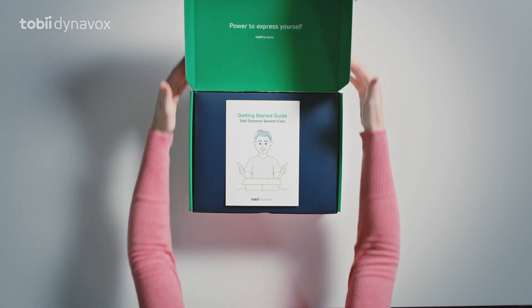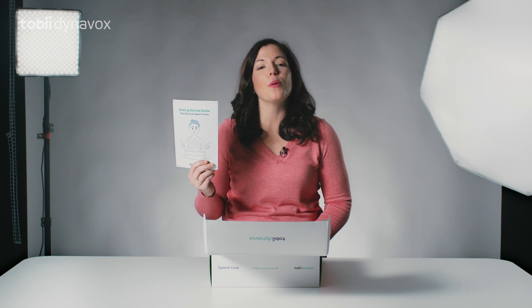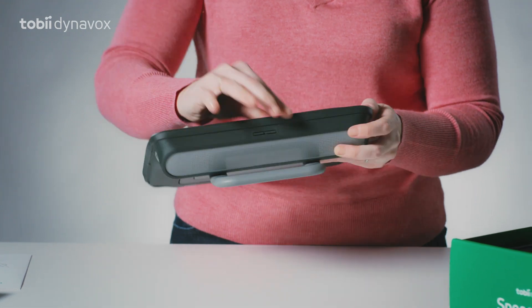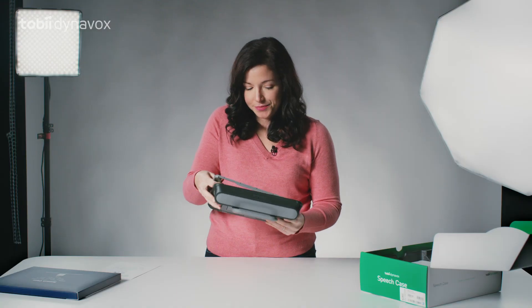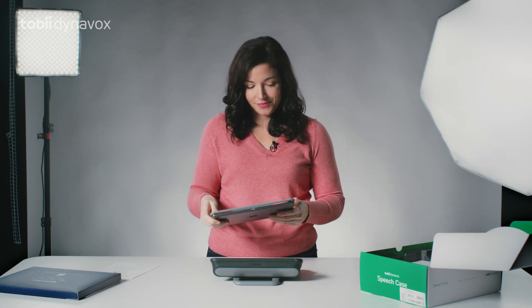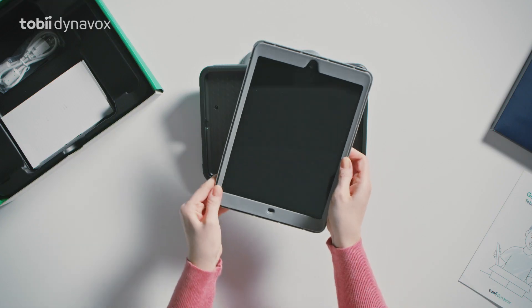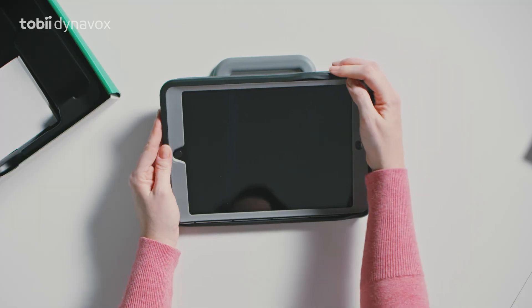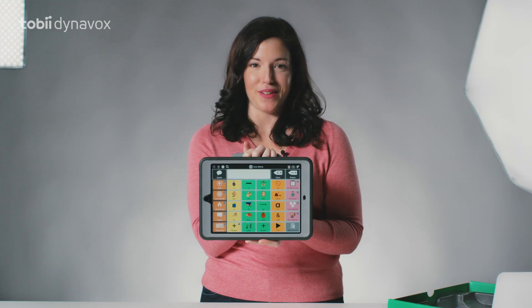First you'll see the getting started guide which has a lot of nice tips to get you going. It will help you pair your iPad to the speech case. To get started, remove the faceplate from the case and snap it on the iPad, then place it in the case and wrap it around the faceplate.